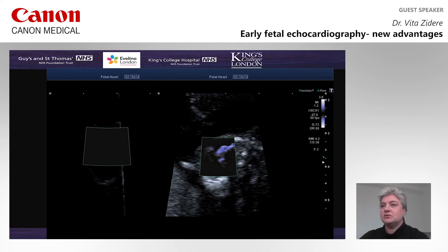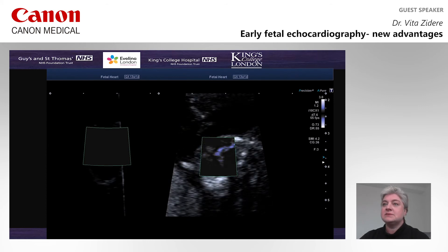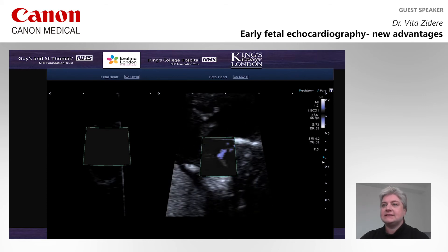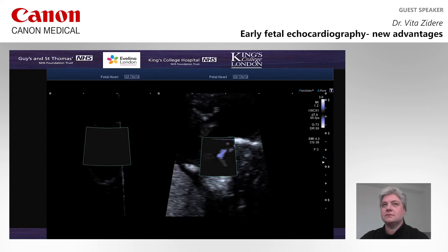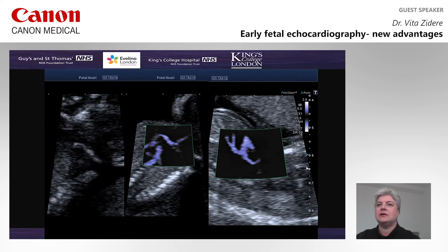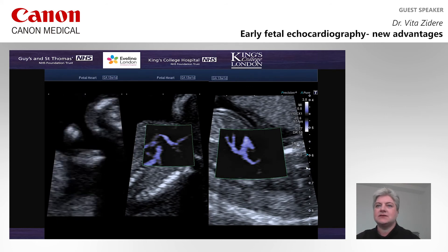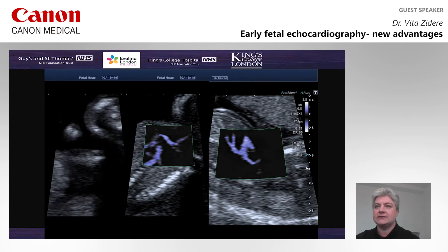The three-vessel view shows dilated pulmonary artery and duct, good-sized superior vena cava, and small ascending aorta, with a very delicate transverse aortic arch. Now we are looking at the sagittal view, where on grayscale we really cannot see the transverse aortic arch. Therefore, SMI is applied.